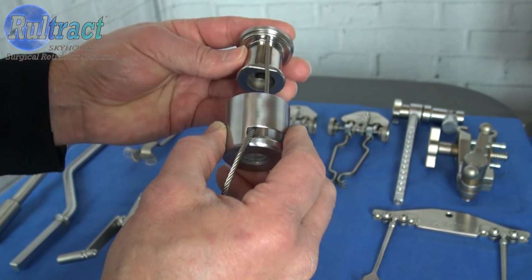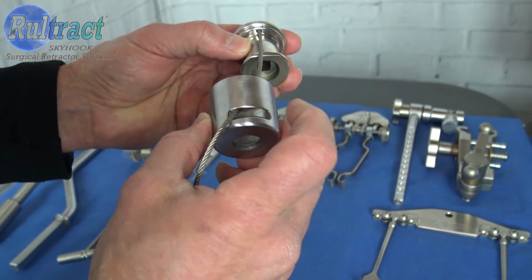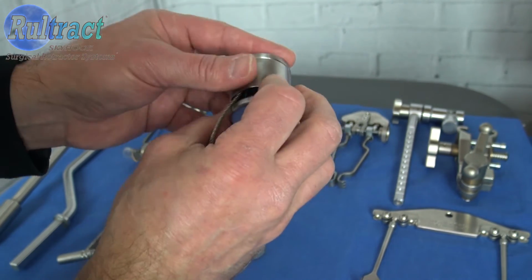If they're not lined up properly, they won't go together easily. So make sure the cable's hanging over the flat surface. The cable guide is lined up with the flat surface, and go ahead and put them together.